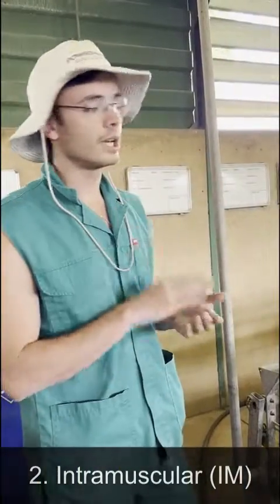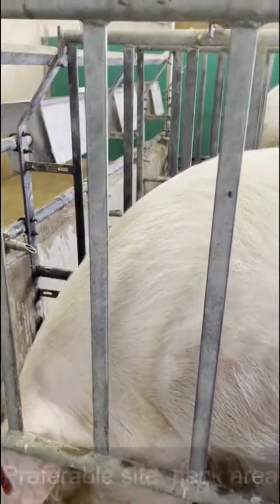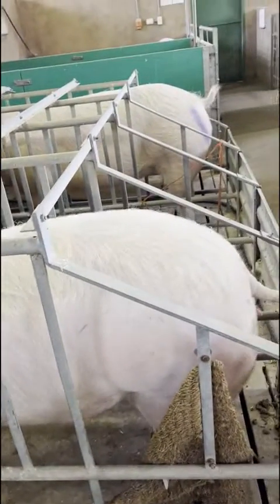On pigs we don't really use the coccygeal vein, but we do in animals like cattle. Intravenous injections are done at a 45-degree angle. Then we've got intramuscular, done at 90 degrees with an 18 to 20 gauge needle depending on the size of the animal. It's done behind and below the ear in the neck for larger animals. For small animals, as we learned in our first session, iron or vitamins are given in the rump. For larger pigs it's the prime — the neck muscle. We've also got subcutaneous, intraperitoneal, and intradermal.